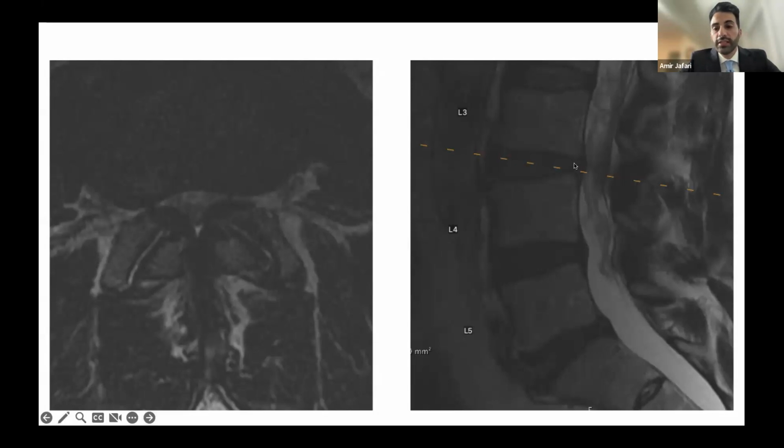But you could see here that the stenosis is so bad. It's causing nerve root edema. You see how these nerve roots are getting thicker? Here at UF, we call it the Gator sign, but I'm sure some other people call it something else. But that means that these nerve roots have a tourniquet around them, so they're swollen up. When we go to get an IV in the hand, we put a tourniquet on and the veins pop out. It's the same concept here.